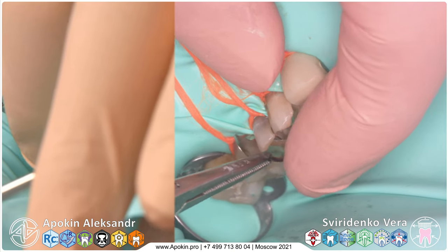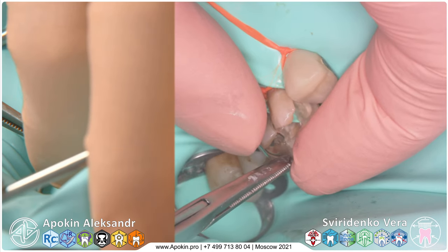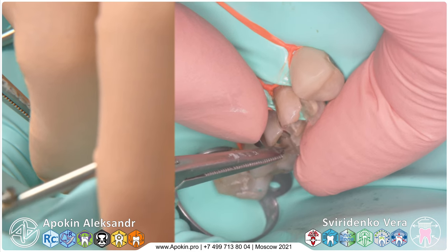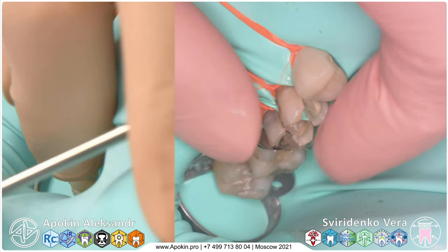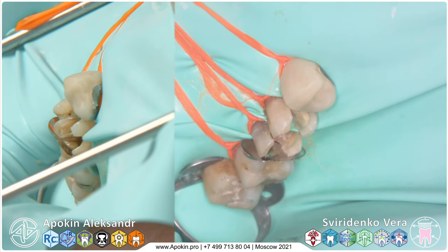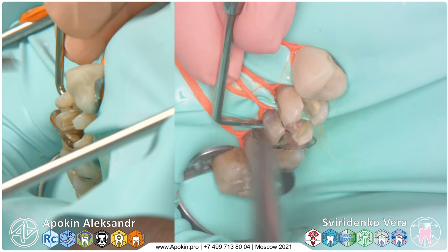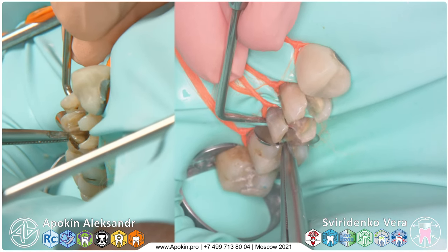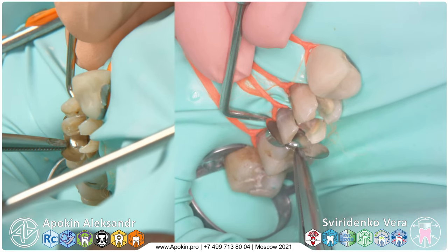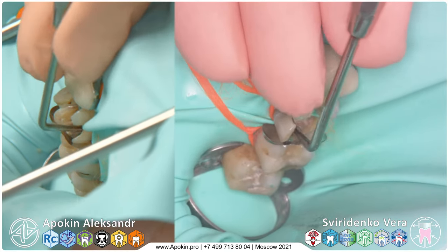We used the surgical needle holder to insert matrices very carefully in interdental spaces. Check only for one thing: you did not contact with the floss. I hold it with the probe and then insert the matrix deeper. Very good, very easy. Okay.